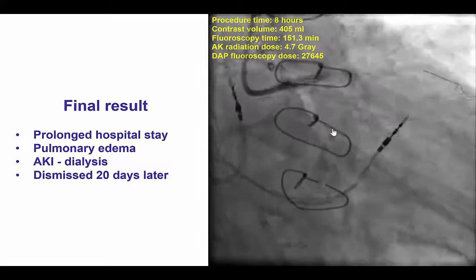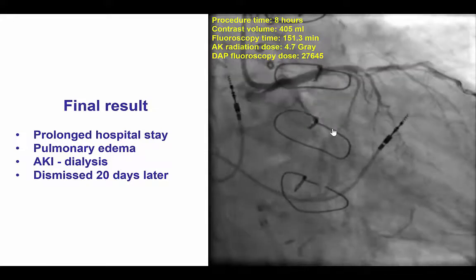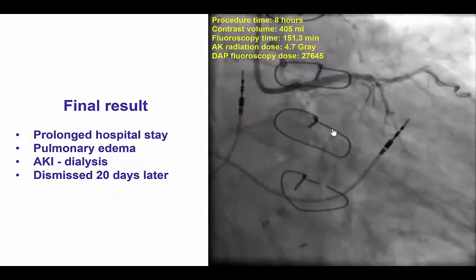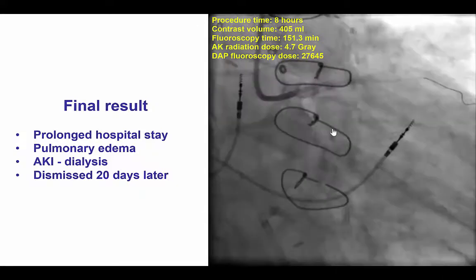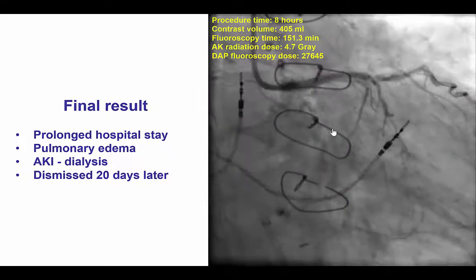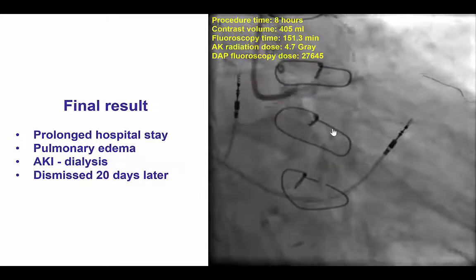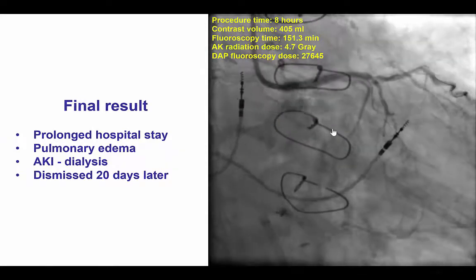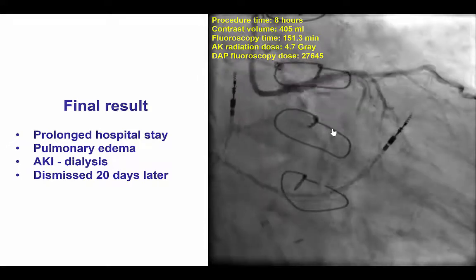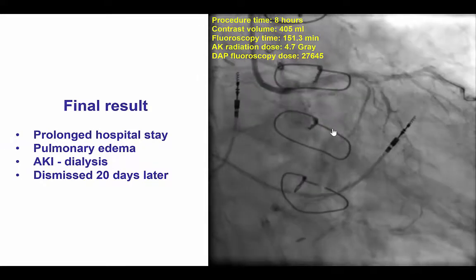We performed additional stenting of the left main because there was dissection at the area of entrapment. Eventually we had continued TIMI 3 flow into the left main and the LAD. This was a very complex procedure: 8 hours of procedure time, 405 mL of contrast, 151 minutes of fluoroscopy, and 4.7 gray radiation dose with a DAP of 27,645. We had contemplated sending the patient for coronary bypass graft surgery, but that would have carried significant risk given the patient's previous bypass, kidney failure, and heart failure.